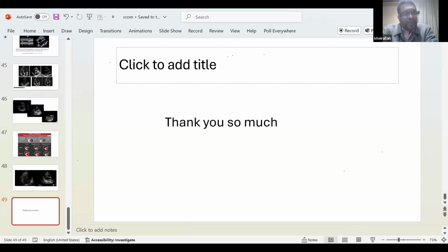Thank you, Dr. Nafisa, that is humble of you. We say that CMR is the Supreme Court in cardiology. When we get stuck with any ambiguity at a lower level of imaging, we go for CMR, because CMR is more objective, it's software related. Ultrasound, no matter what we do, is operator dependent. It's about how the technician does the study, the patient's image quality, his echogenicity, the measurement, the alignment, and then the interpretation. Things are a bit different, and therefore we might get lost.